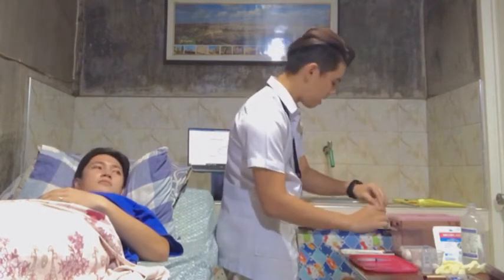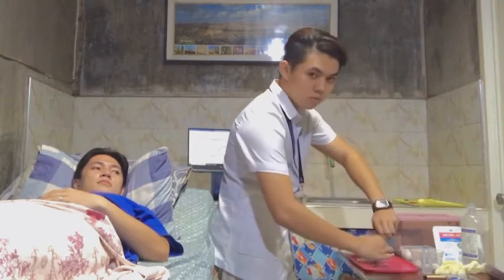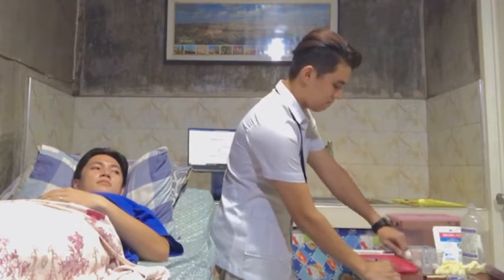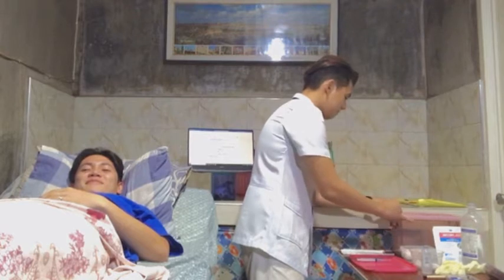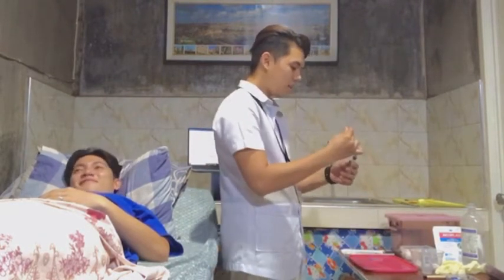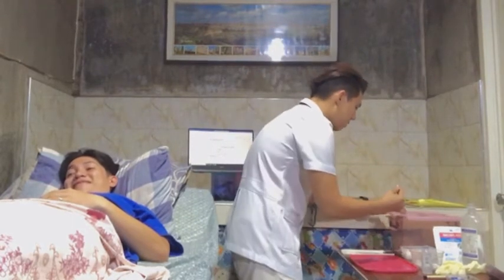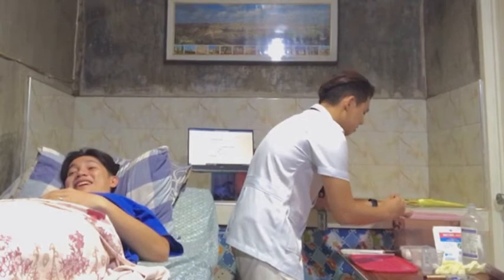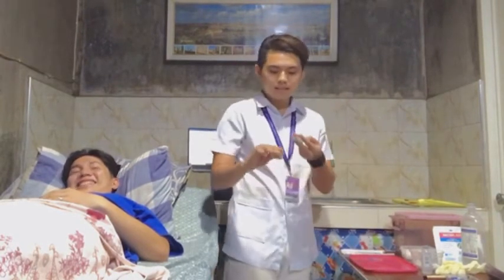So let us start. Just twist, and then like that, and then bring this one in the waste receptacle. So of course, withdraw the medication with your syringe. So this is the aspirating needle first, and then we will be withdrawing 3 ml.